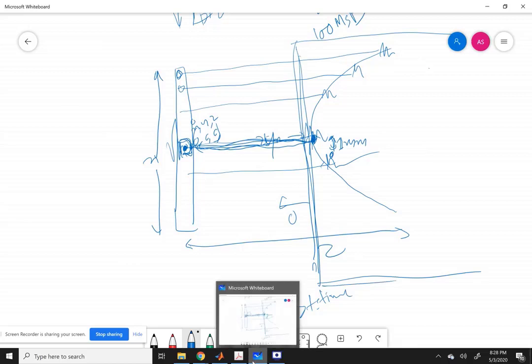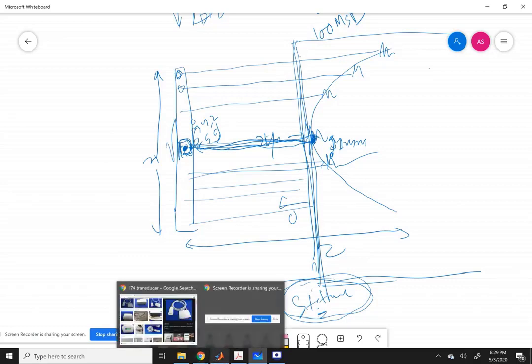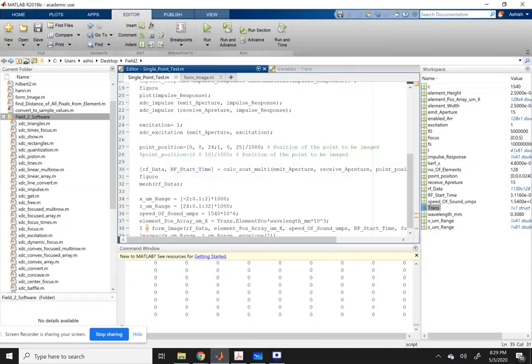The RF shown is only from this point onwards, and it additionally returns a start time to save space. It doesn't want to fill RAM with data which it knows is all zero. So it gives you this start time value, so you can add it to all your calculations in order to find out where the signal is coming from. So you get a scatter.